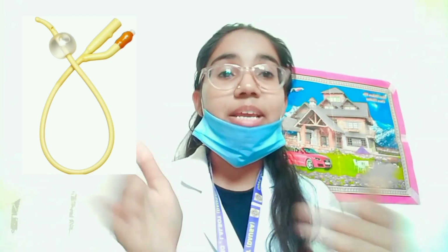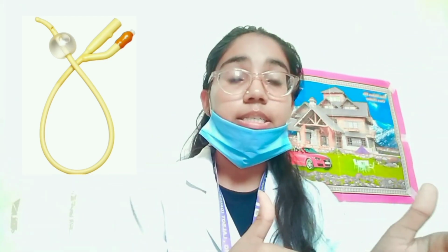And the second one is the Coude catheter. This catheter is more rigid than other straight catheters. This catheter may be used in male patients with prostatic hypertrophy, meaning those patients in whom the prostate size increases. The third one is Foley's catheter.